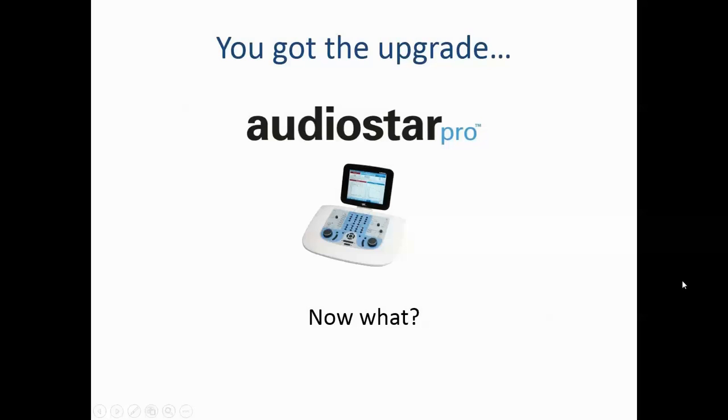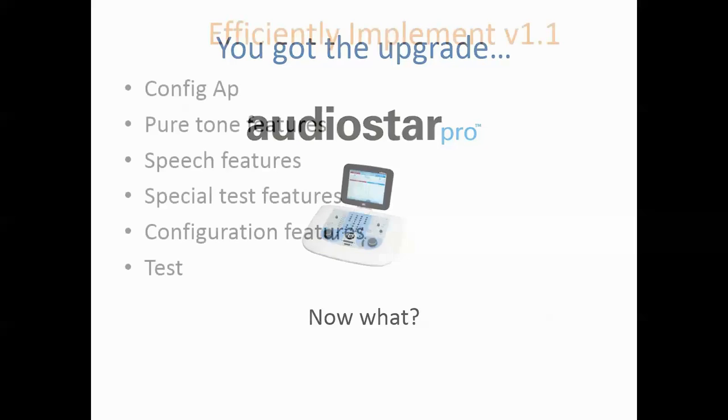You got the upgrade to your AudioStar Pro to version 1.1. Now what? My name is Prigge. I'm one of the audiologists with Grason-Stadler, and I'm going to spend the next few minutes talking about how to efficiently implement some of the features in the new version 1.1 of the AudioStar Pro.